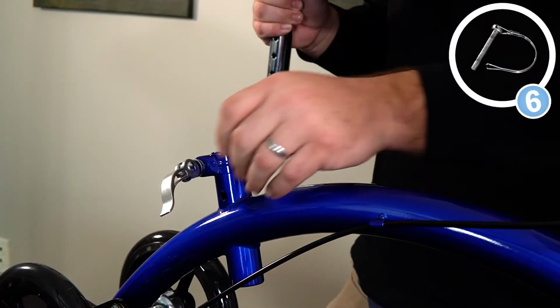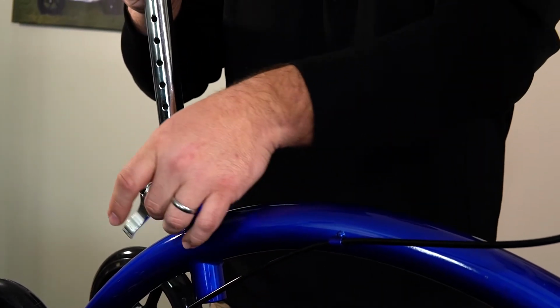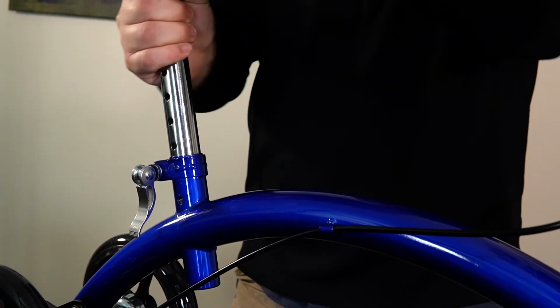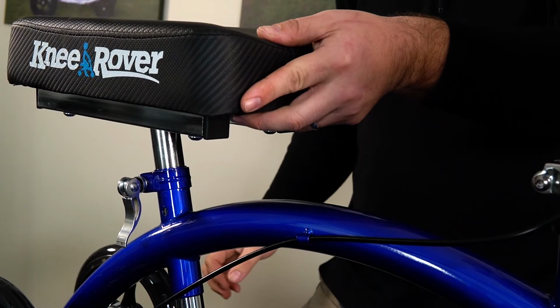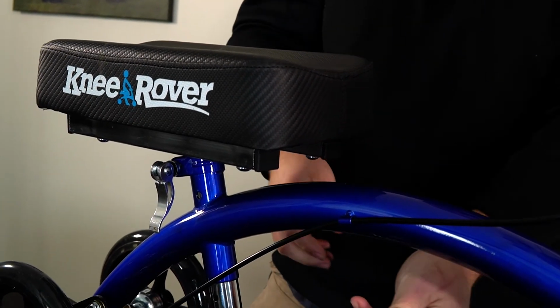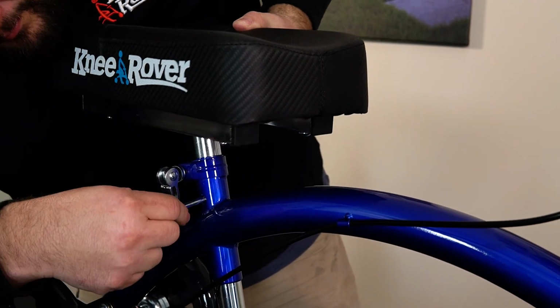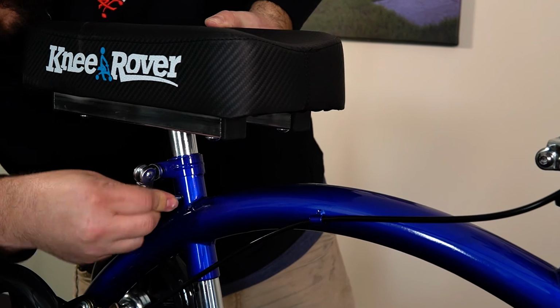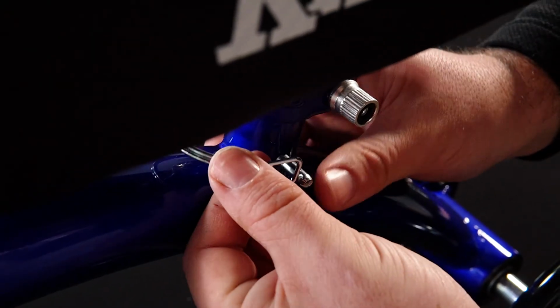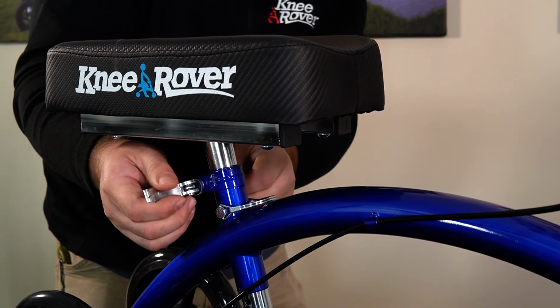The 6th step is to install your knee platform. To do that, you're going to open this lever up, drop the knee platform into the hole, find your desired height. You're going to take one of these locking pins, put it in the hole here, and lock it in on this side. And then you're going to take this clamp here and clamp it around.